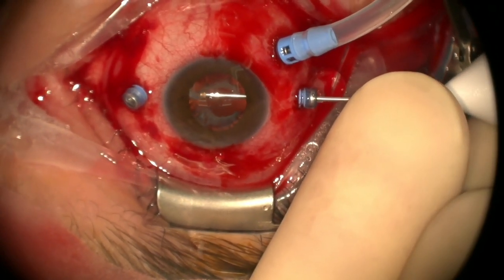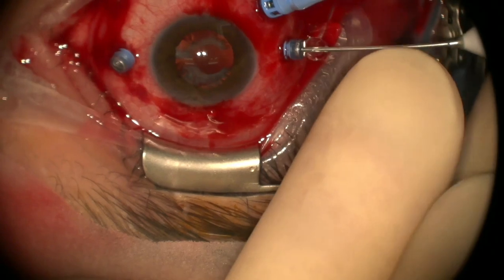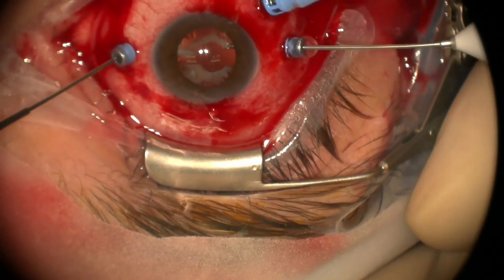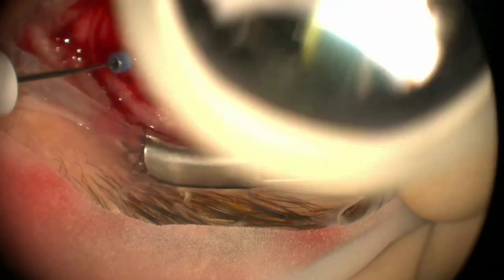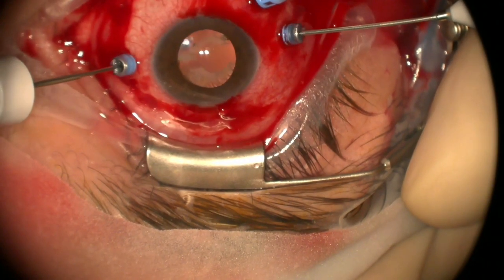We could take more of that out, but I don't know that we have to. We're going to try and do that this case without taking all that out. As long as we opened up the aperture, I think we'll get a pretty good view. Hang on a second, something's a little. Yeah, I think it's just an oil droplet, and it is again.